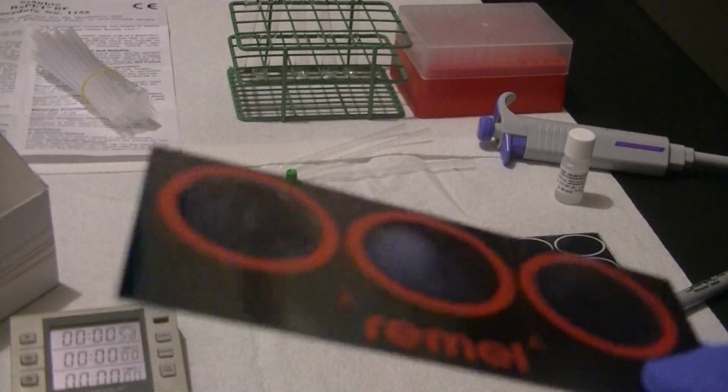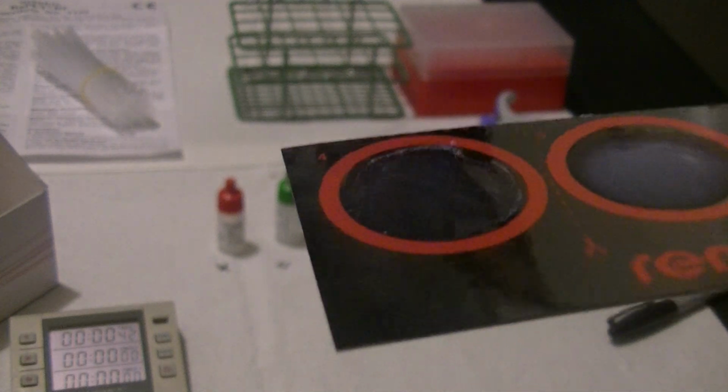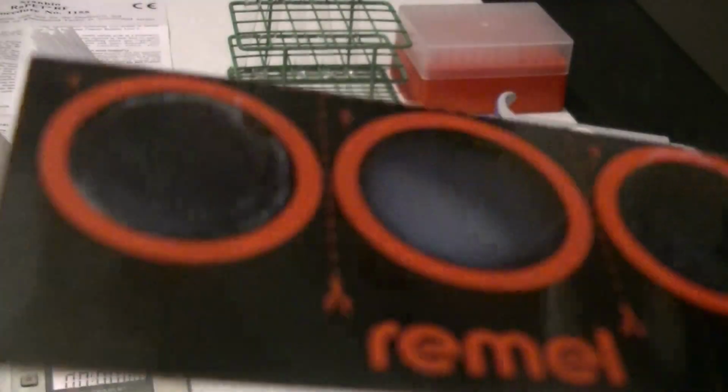You can already see that the reaction circle to the left is starting to show some small visible clumps, or agglutinates. The latex particles are already starting to clump together, which is what we expect in a positive control. The negative control is not showing us that same reaction.